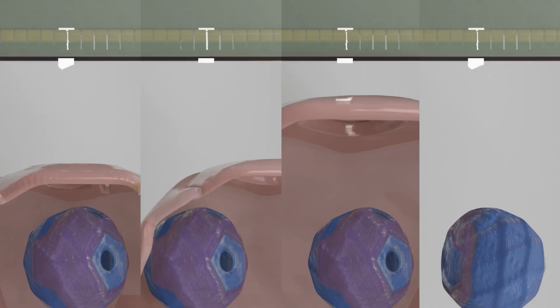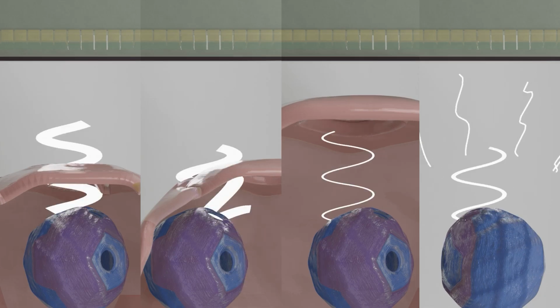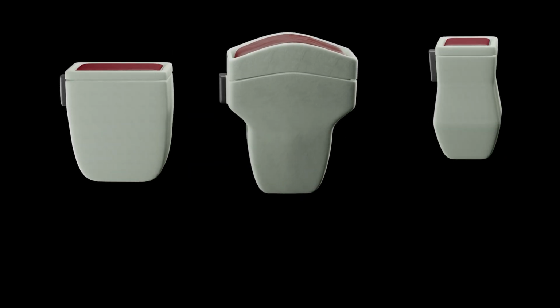Even the most advanced ultrasound machines have interactions with tissue. This interaction is responsible for measurement errors, artifacts, and poor picture quality. It is important to understand how to avoid these errors and misdiagnosis. As the ultrasound beam penetrates the medium, the beam loses energy. The beam is reflected, refracted, or absorbed as heat generation. The amount of penetration will determine the depth of the scanning area.